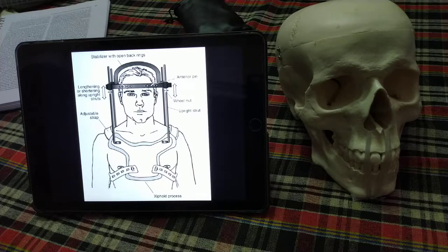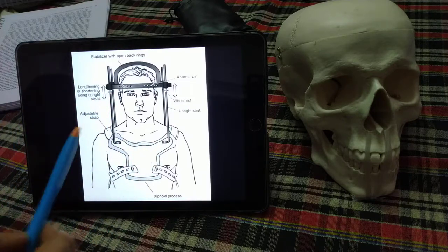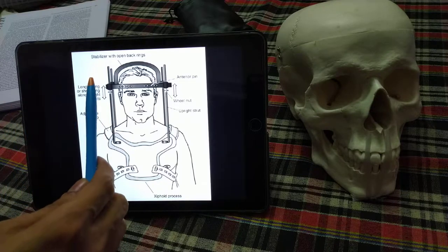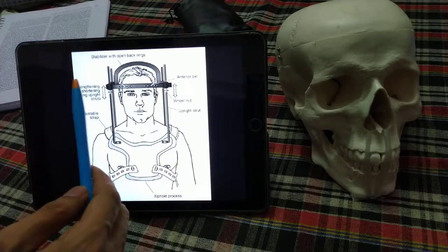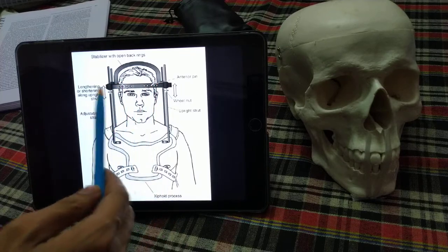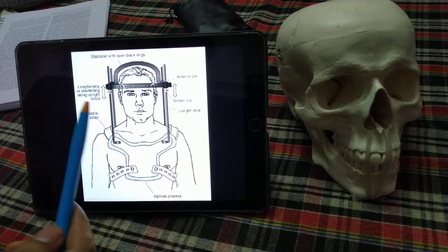Today's topic is the Halo Cervical Orthosis. It consists of various components which we will discuss one by one. The first component is a metal ring, which is mostly U-shaped but sometimes circular. It covers laterally and anteriorly, while it is deficient posteriorly in the occipital region.